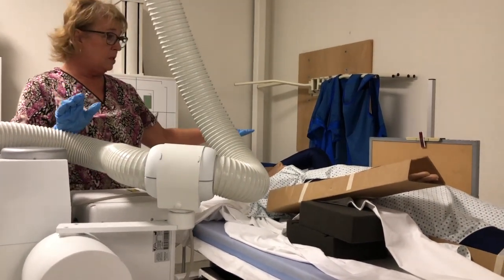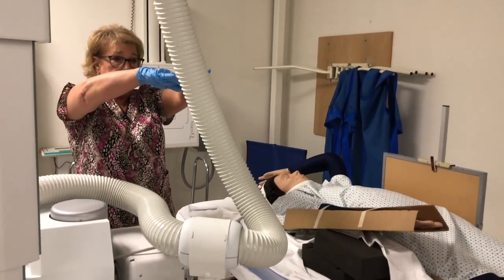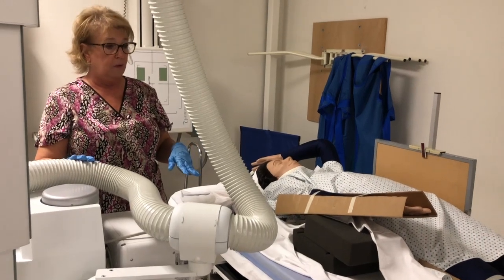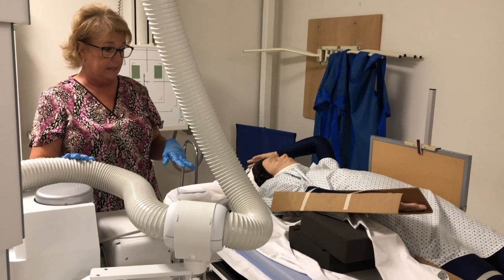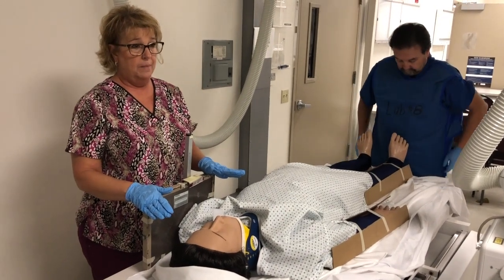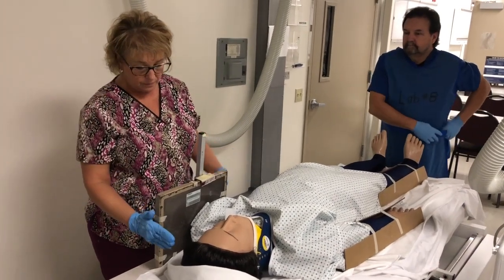If both arms were traumatized, I would be elevating both arms up and maybe trying to cross them on the abdomen just a little bit. You really just have to be creative, and you're gonna learn good tricks of the trade from the techs that you work with. So the cross table lateral C-spine is typically one of those images that's taken portably in the emergency department, but we can still demonstrate it here.